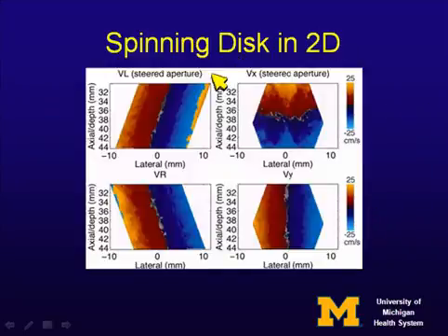So you can, like I said, steer towards the left, and you get this image, and then you can steer towards the right, and you get this image, and then all you do is combine them, and then what you end up with is the x component, which is transverse, so these guys are all going that way, and these guys in the far field are going that way, and you can do the axial image, so those guys going up there and down there.